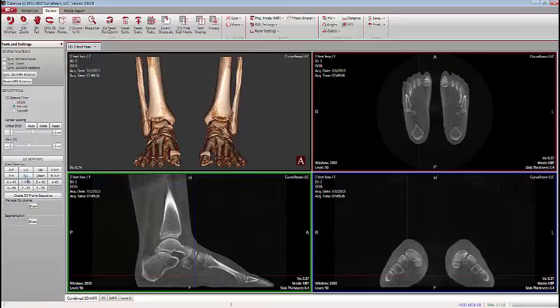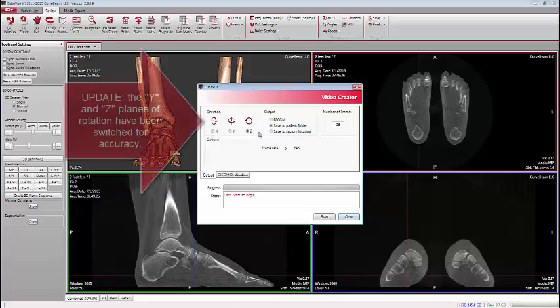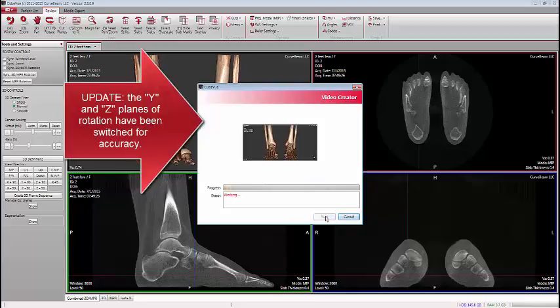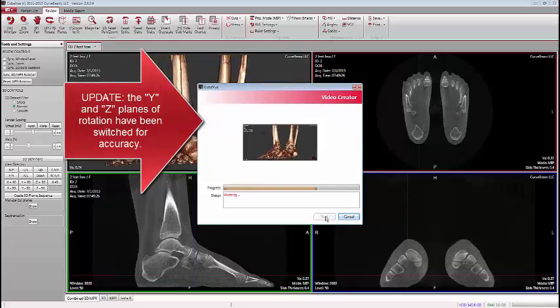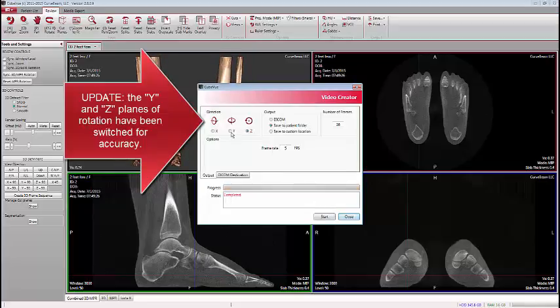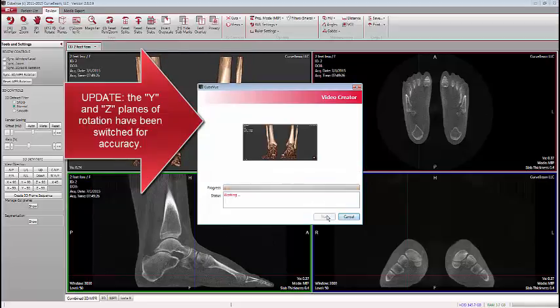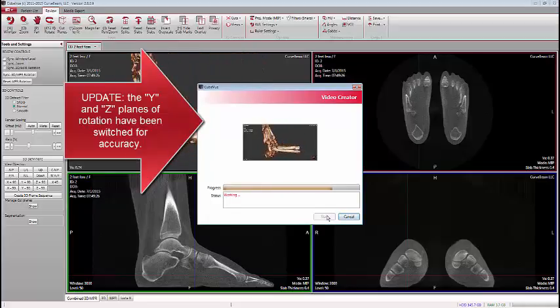There's also been a modification to CubeView regarding the planes of rotation — the X, Y, and Z planes. The X plane still looks the same, with the toes rotating up from the top. If we go to the Z rotation, however, it now looks like the Y rotation used to. Please be aware of this change. And if we go to the Y rotation, we flip it up 90 degrees and then rotate around the true Y plane of rotation.